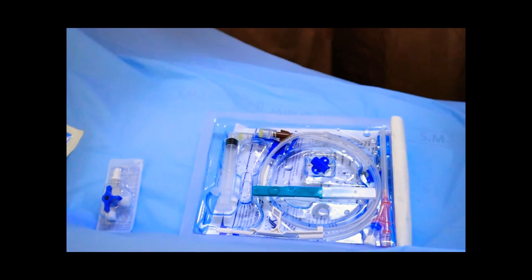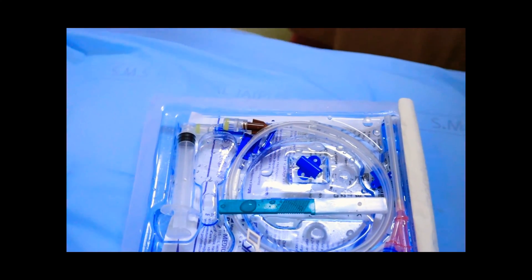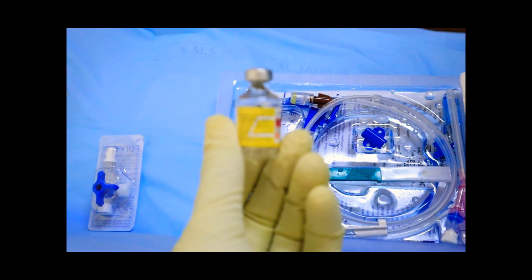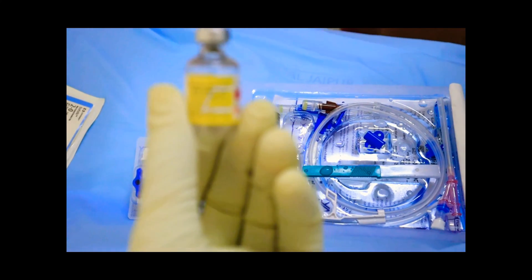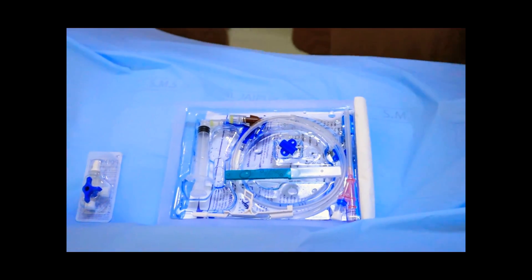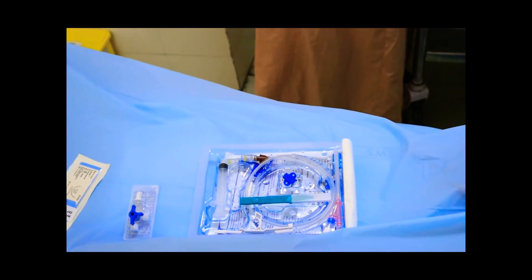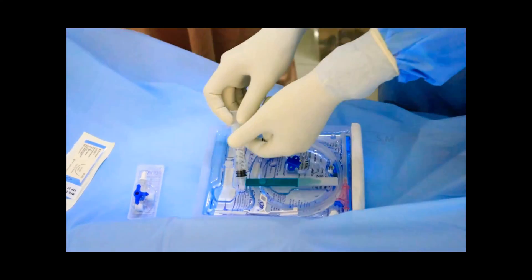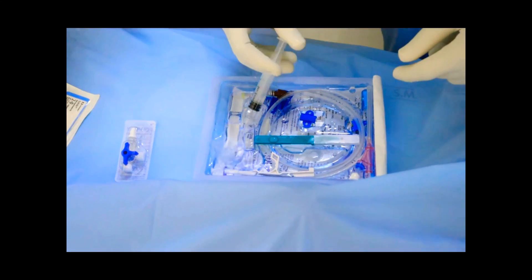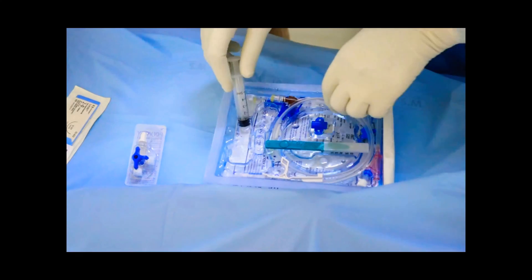We have prepared the equipment in this central venous line kit. The patient is placed in the Trendelenburg position. We have properly sterilized the area and prepared the skin with antiseptic solution, using a sterile full body drape and surgical towels covering the body, head, and face, exposing only the necessary area. Now we are flushing the ports of the catheter to ensure appropriate functioning.